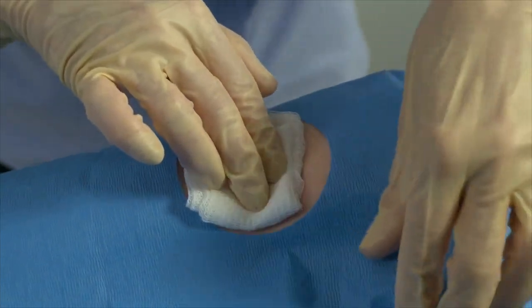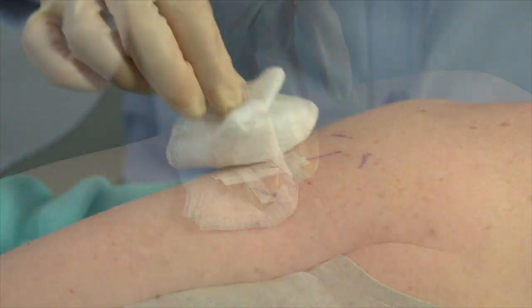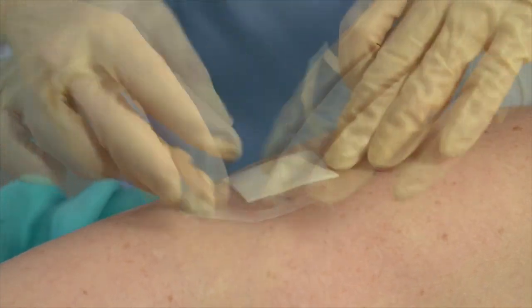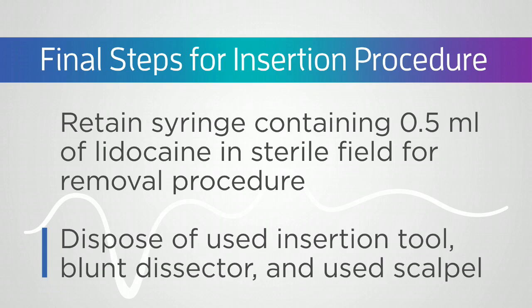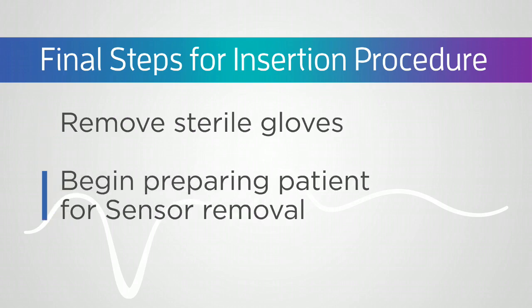Place sterile gauze over the steri-strips and hold it in place while removing the drape with aperture. Then apply a padded tegaderm over the steri-strips. Avoid touching the patient's skin while applying tegaderm. Retain your syringe containing approximately 0.5 milliliters of lidocaine in the sterile field for the removal procedure. Now dispose of your used insertion tool, blunt dissector, and used scalpel in accordance with your administrative policy. Last, remove your sterile gloves and begin preparing your patient for sensor removal.